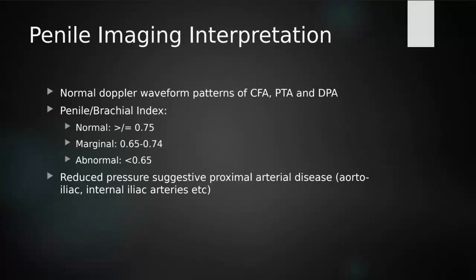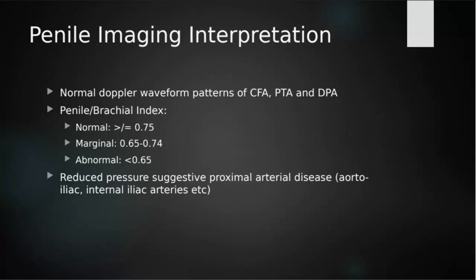So interpretation of this, we're doing a penile brachial index. We have our numbers right there that we can evaluate.